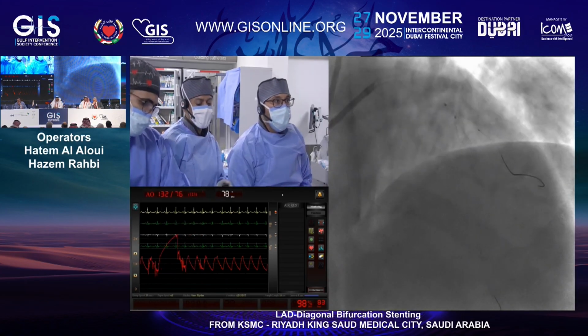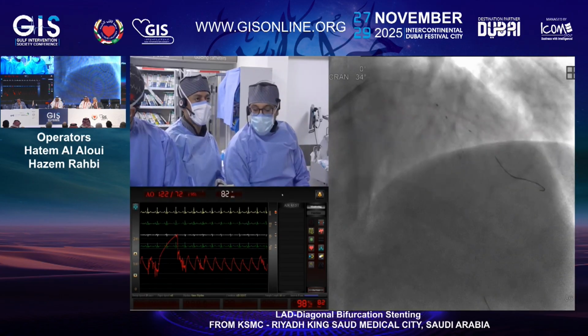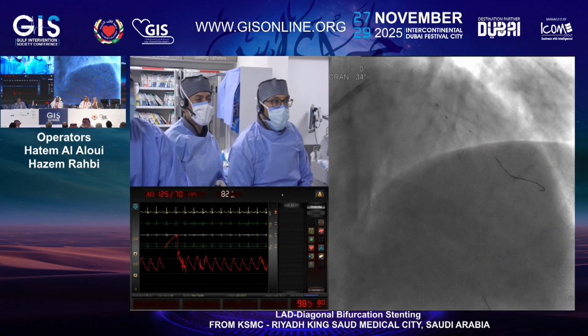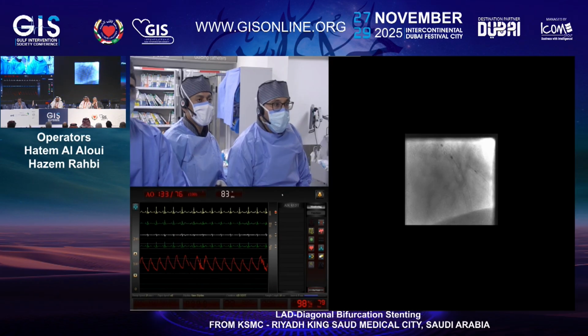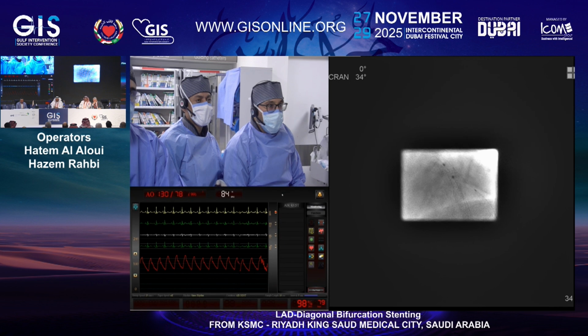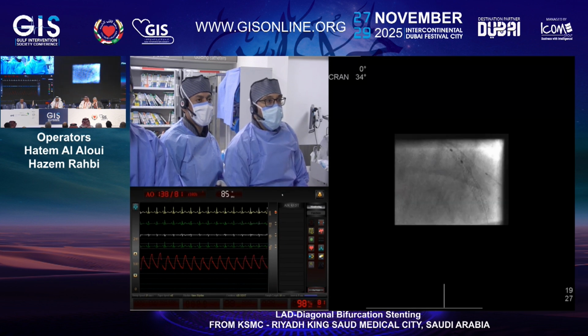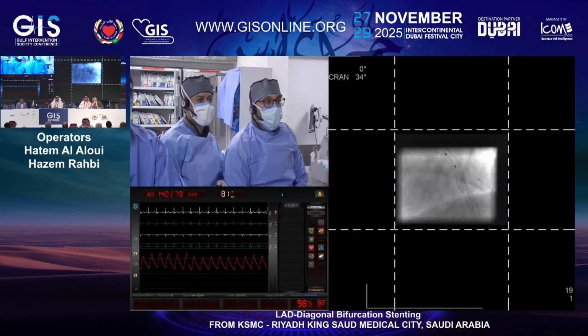Go up, please. So proximally, let's see proximally how we are. Let's do a boost. So we have two major important elements here. It's not to protrude back before the first strut and not to protrude beyond the carina. So I think proximally we are not bad.